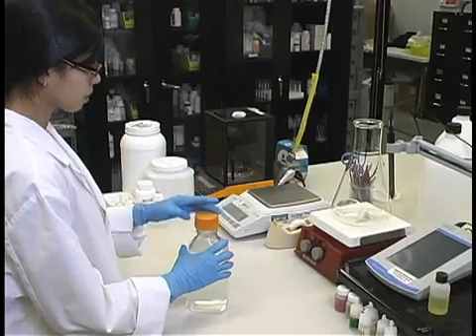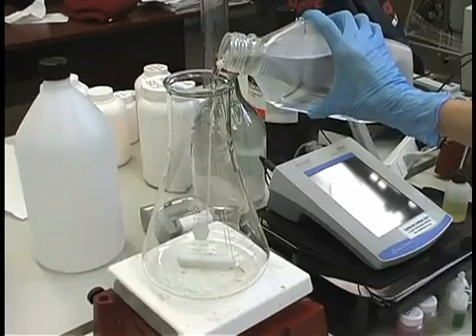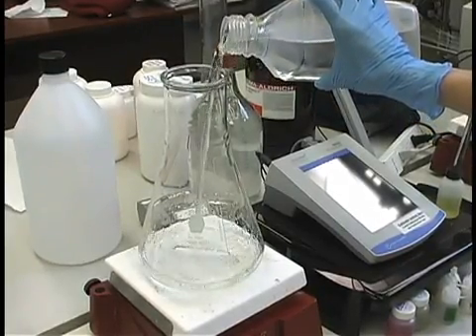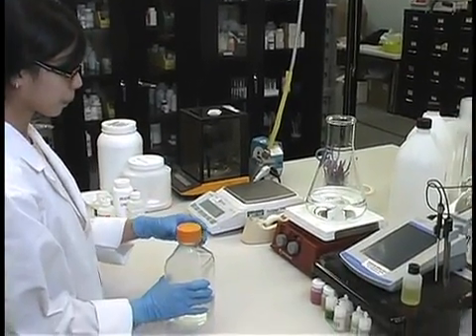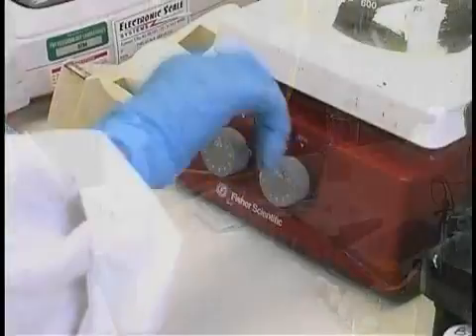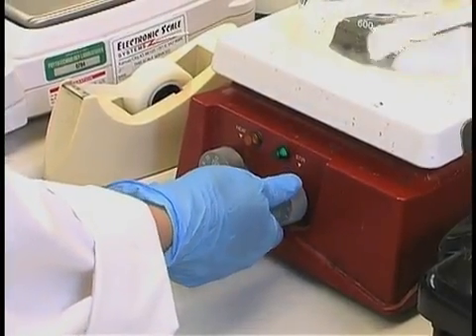Measure out 80% of the final volume of water required for the batch of media being prepared. Be sure to use tissue culture grade water, or product number W783 if you do not have access to tissue culture grade water. Add the water to a container that can hold at least one and a half times the batch size of the medium being made. Add a stir bar to the container and begin slowly stirring the water.